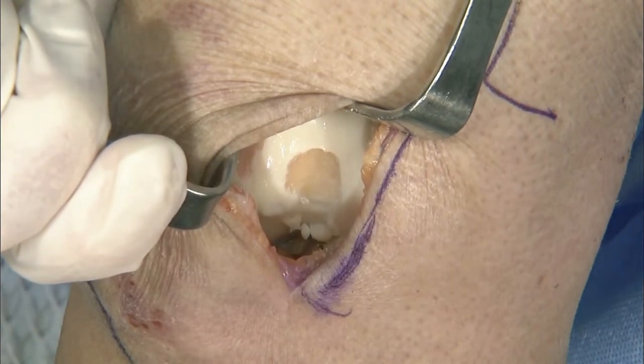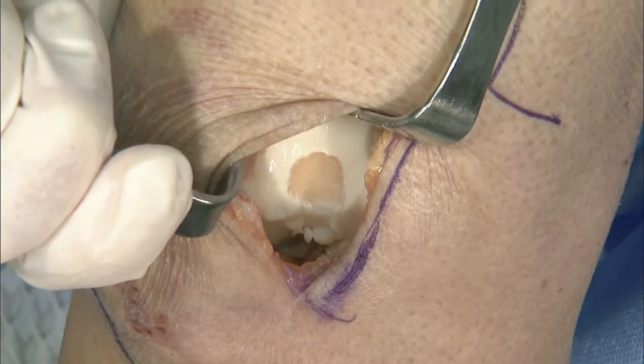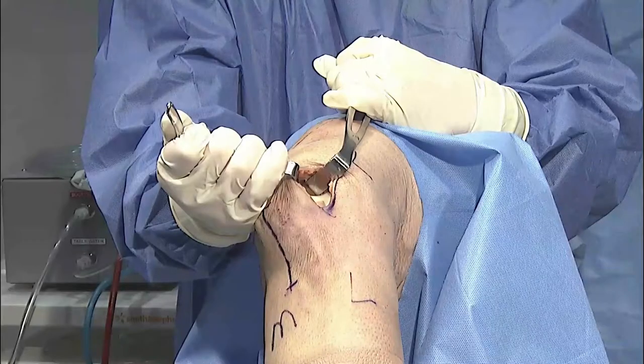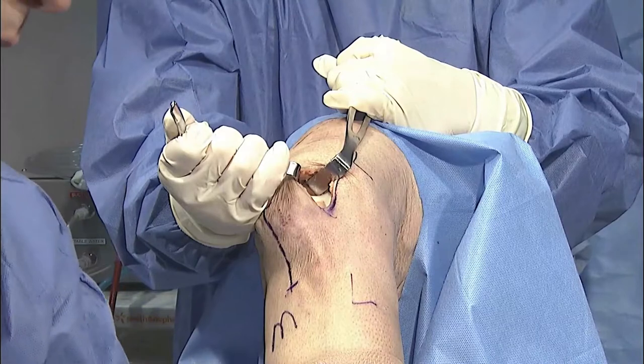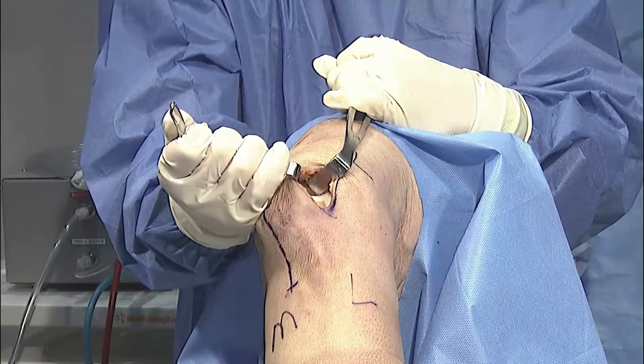So essentially now what you're going to do is... Jeff, just to be clear, it's something that I just started doing recently based on a recommendation: you actually lay the foil into the Tegaderm. So you peel up the sticky part, put the foil in, lay it back down, and then that all stays as one unit. Oh, gotcha. Yeah, no, I think that's a great pearl. I will certainly try that.